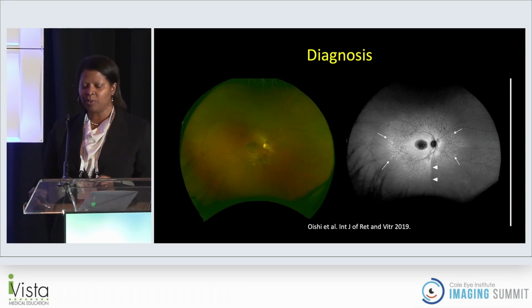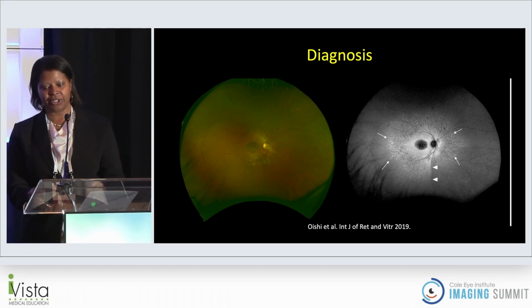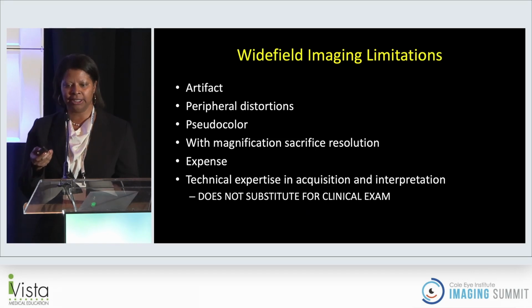Diagnosis, also, ultra-wide field autofluorescence is excellent for diagnosis. You can tell in this patient who maybe would have a conventional photograph, you may have missed these pisciform flecks there outside of the overall macula here, showing hyperautofluorescence.